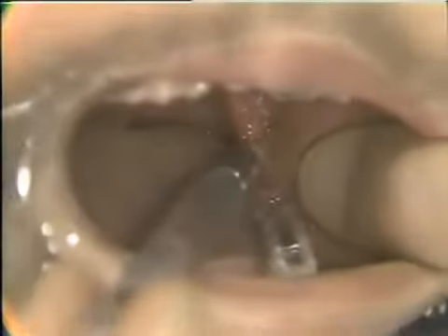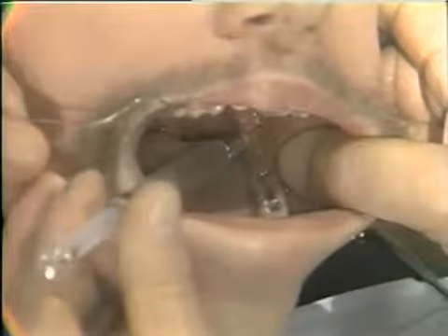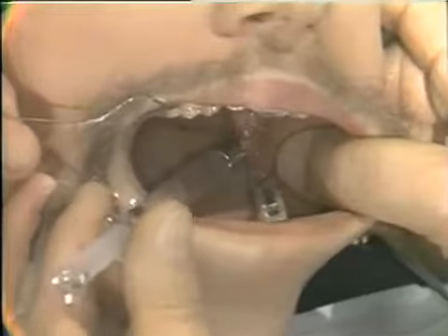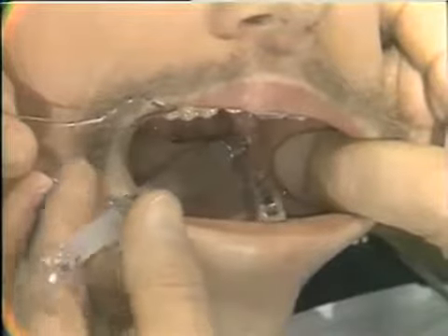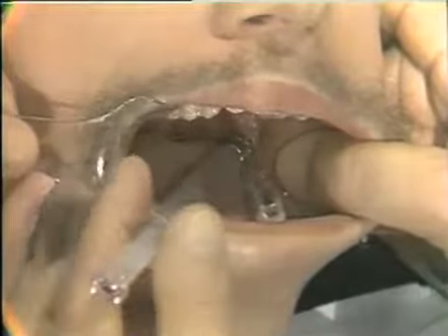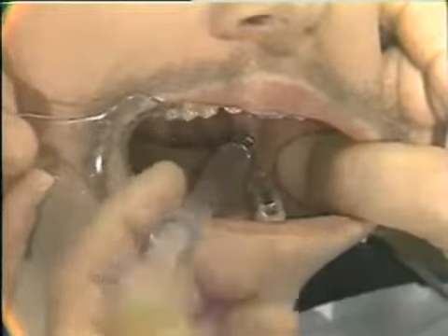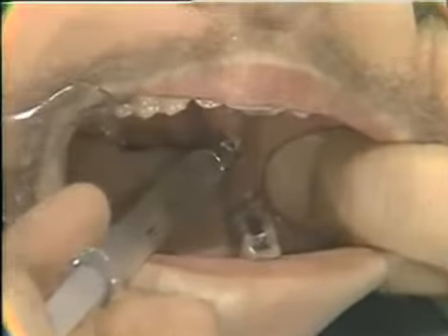The puncture is made, and I have penetrated approximately a centimeter and a half. Now I know I am by the obstruction of the internal oblique line. Now I'm going to increase the angulation of the syringe slightly so that now the barrel is approximately over the molar on the other side. And I'm going to sneak on in and very gently try to get needle contact with bone at 2/3 of this distance across the ascending ramus. This I have done, and now I'm going to aspirate carefully, and we see that we're in a safe position. And now I'd like to show, if we can, my rate of injection of the anesthetic solution.